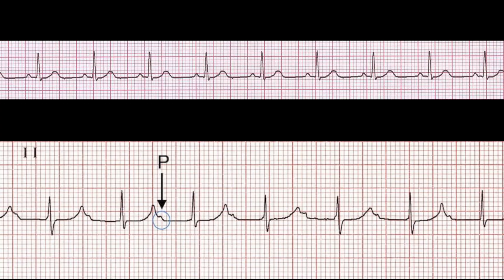On the top portion of the screen you'll see a normal sinus rhythm — there's a P wave before each QRS complex, a QRS complex, and a T wave, and everything looks normal. On the bottom portion you'll see a first-degree AV block. Look at how far away that P wave is from the QRS complex — that P wave is way too far from the QRS to be normal sinus rhythm.